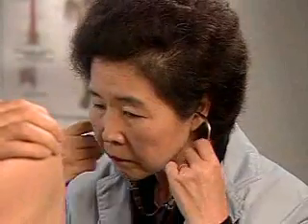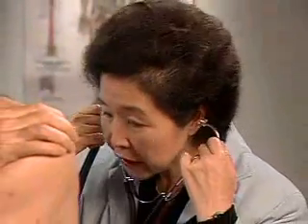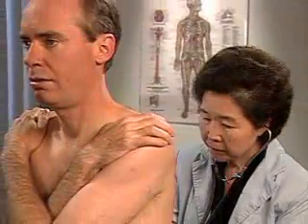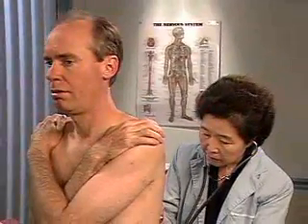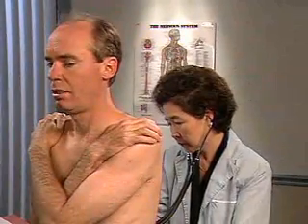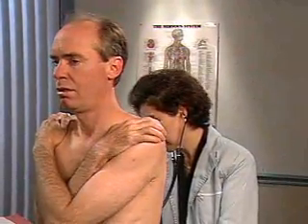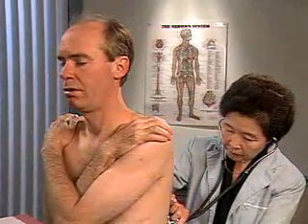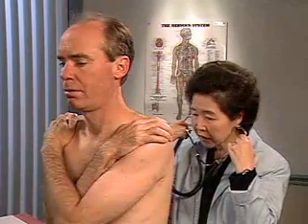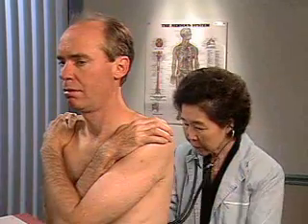If you hear bronchial or bronchovesicular breath sounds where they should not be, listen for transmitted voice sounds. Ask the patient to say '99' while auscultating the chest. Voice sounds that are louder and clearer than normal are called bronchophony.